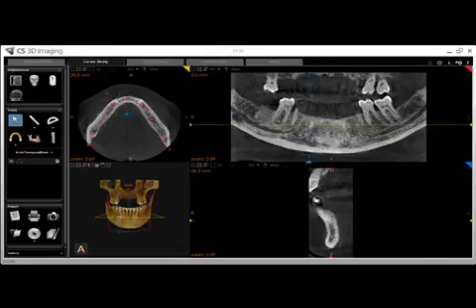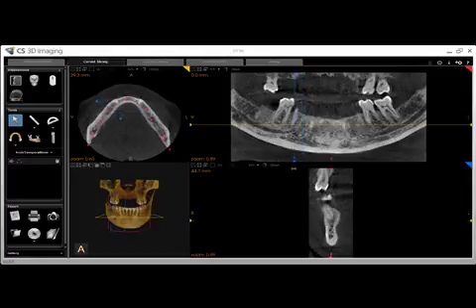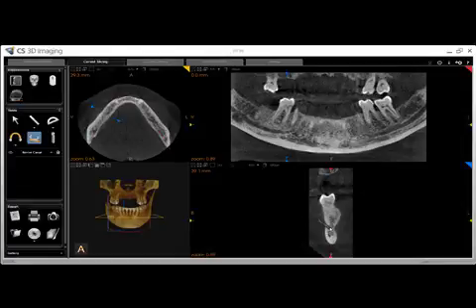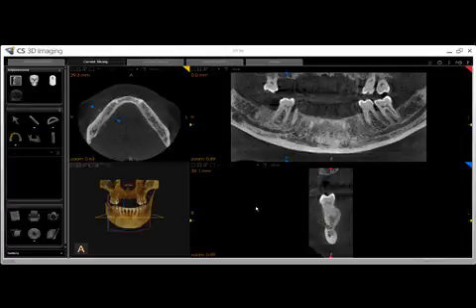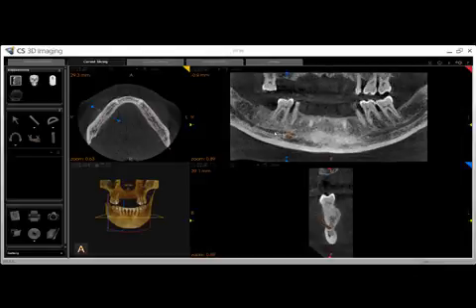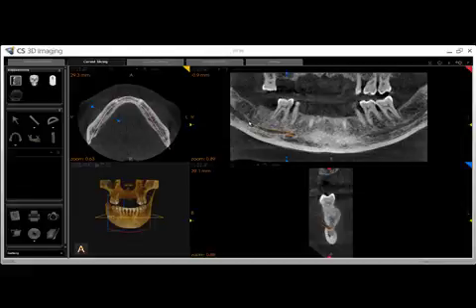To map the mandibular nerve, left-click and hold the larger of the two blue balls in the panoramic image and move until you visualize the mental foramen. Click the Nerve tool, click once outside the mental foramen, once inside, and then move up to the panoramic image to finish tracing the nerve with a series of left clicks along the nerve canal. Use the mouse wheel to adjust the focal trough for better visualization. Double-click when finished.